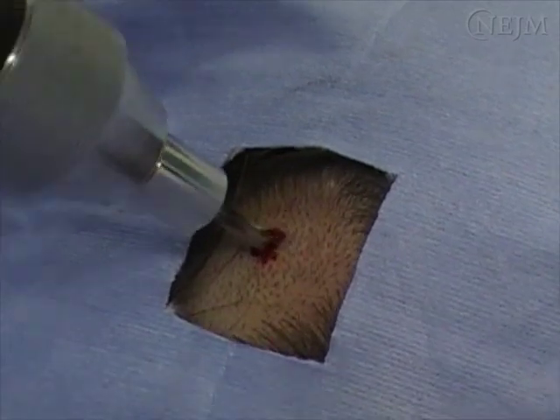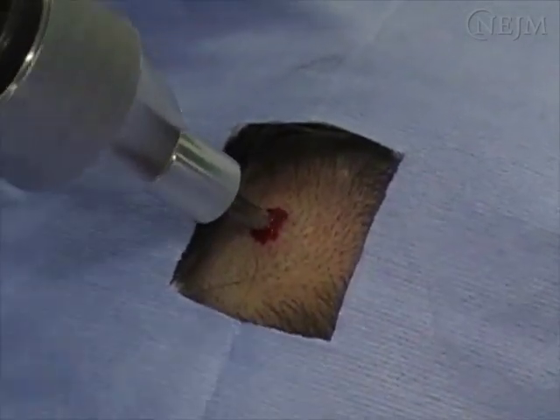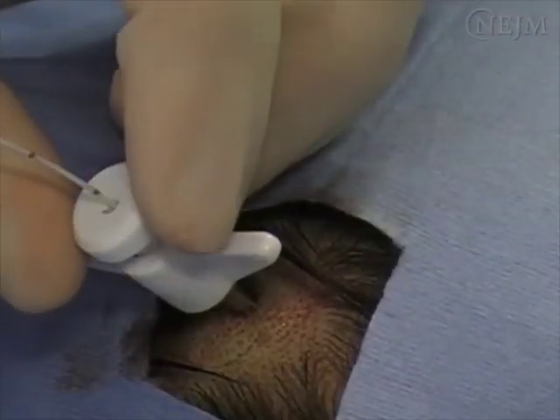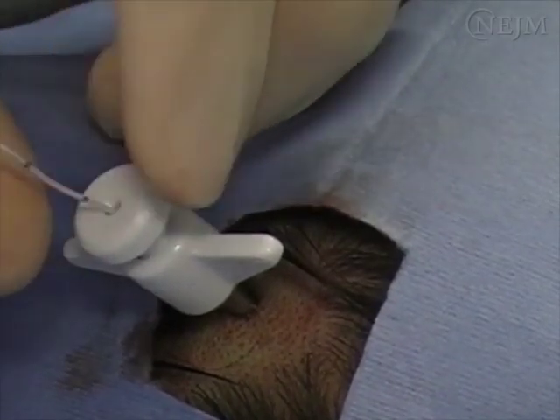Intraparenchymal ICP monitoring is often useful for patients in whom elevated intracranial pressure is suspected, particularly in those with traumatic brain injury. Meticulous technique is important to reduce the risk of complications such as hemorrhage and infection.